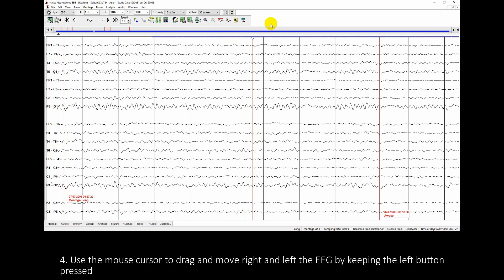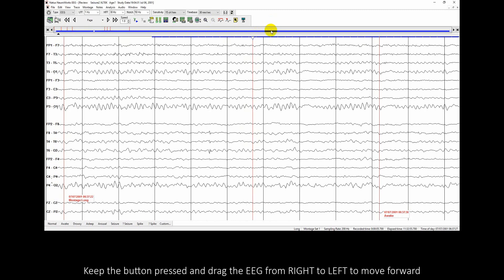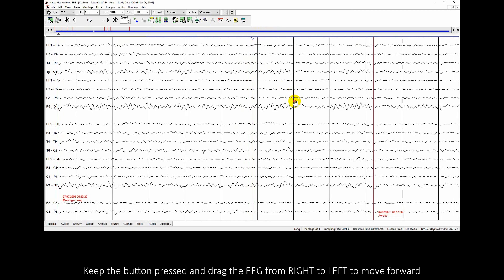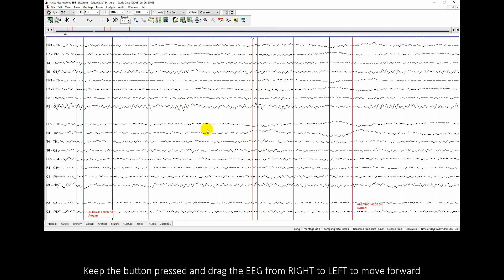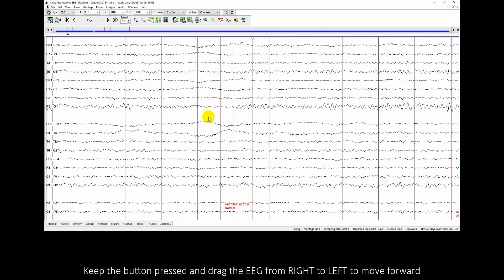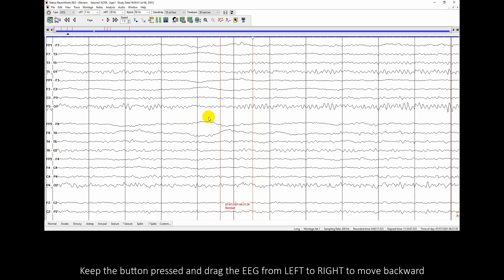Use the mouse cursor to drag and move the EEG right and left by keeping the left button pressed. Keep the button pressed and drag the EEG from right to left to move forward, or from left to right to move backward.